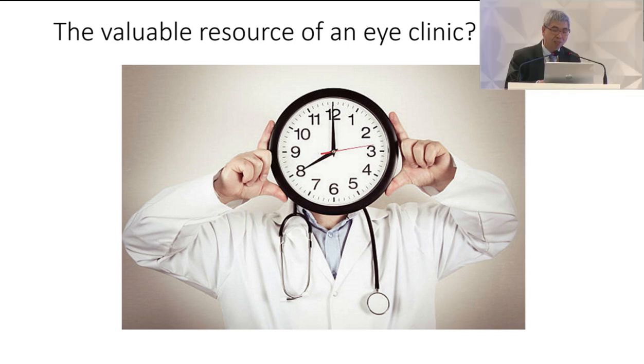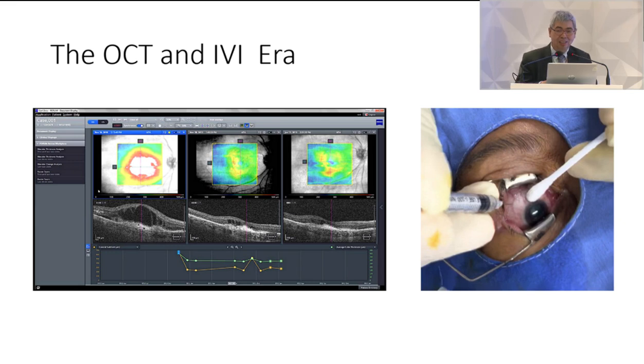The most valuable resource of an eye clinic is likely the time of the doctor. And these days in a retina practice, we spend a considerable amount of time looking at OCT images and injecting medicines into the eye.